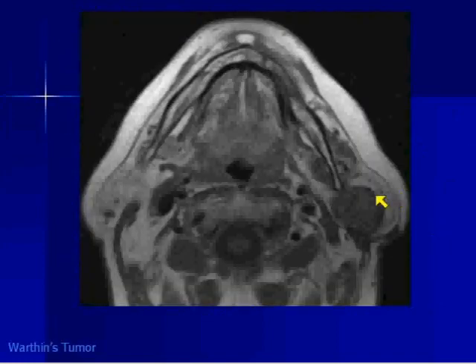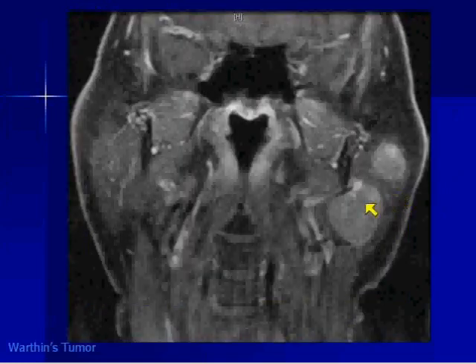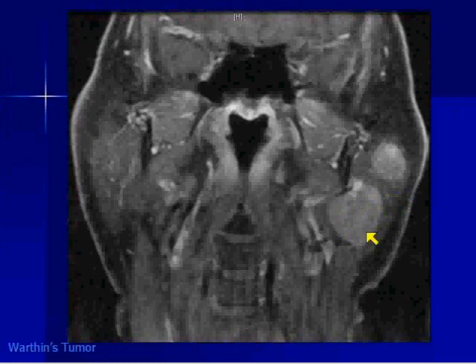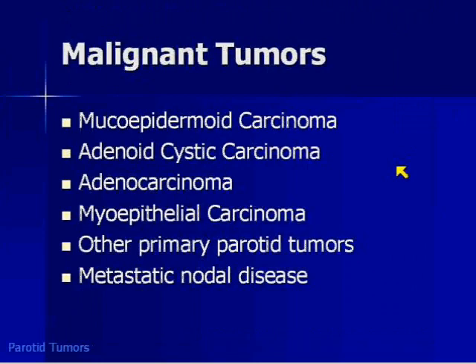Here's an example of a well-defined lesion — this one happens to be solid — in the tail of the parotid gland. This is a Warthen's tumor. There's no cystic element in this one, but it could be cystic, solid, or combined. Same patient: it's nicely enhancing, and you see a second lesion. He's a smoker, he's an older guy — this is more consistent with Warthen's tumor.